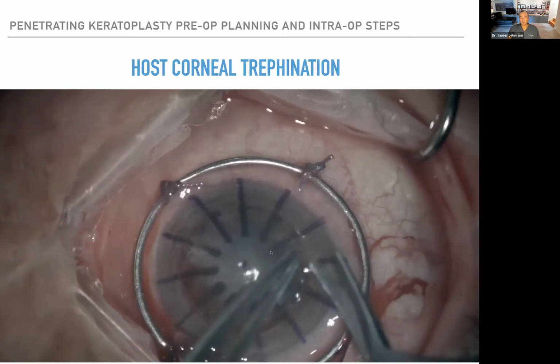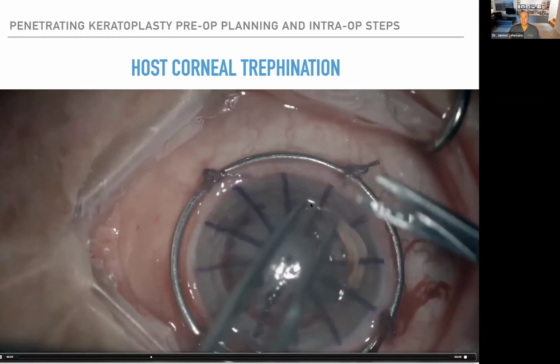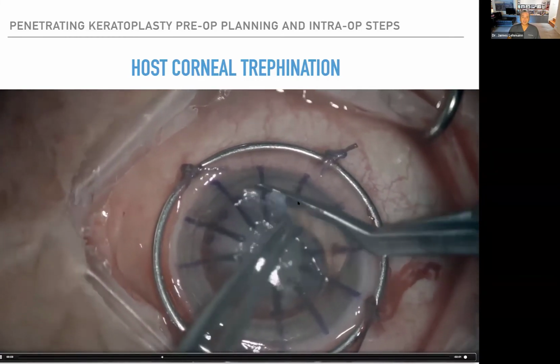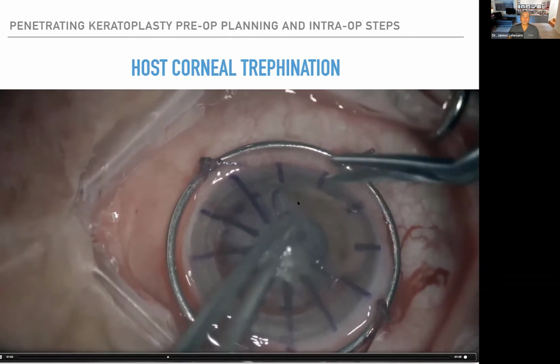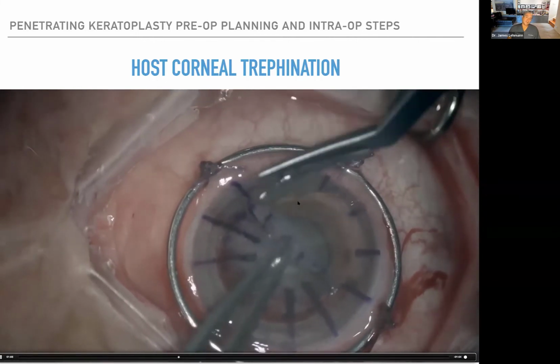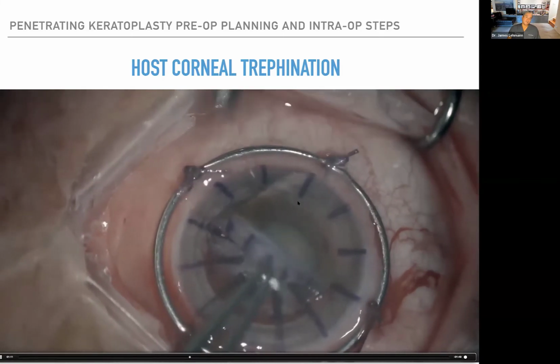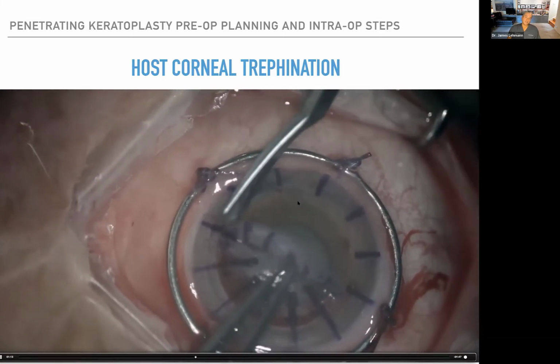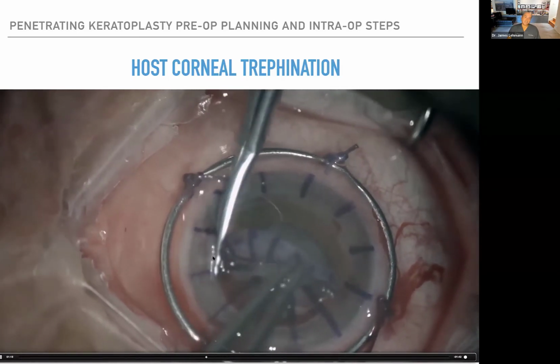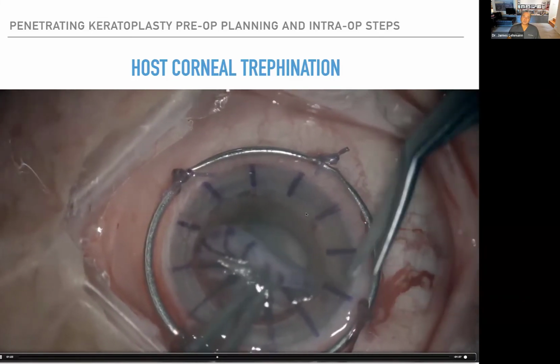Now, the critical thing with this step is that the inferior aspect of the scissors has a longer jaw, and you can visualize it so that you don't cut the iris. So you visualize it, and then you lift a little bit so that you're not going to cut the iris. You go all the way around until it's uncomfortable with your hand, and then you go back the other way. So again, you see the jaws of the scissors. You have to visualize it, and they have to be perpendicular so that you don't get an edge like that. I didn't make it so perpendicular in that area.